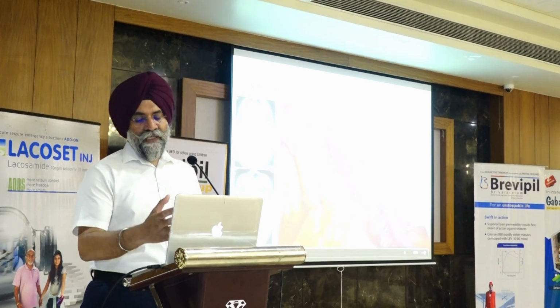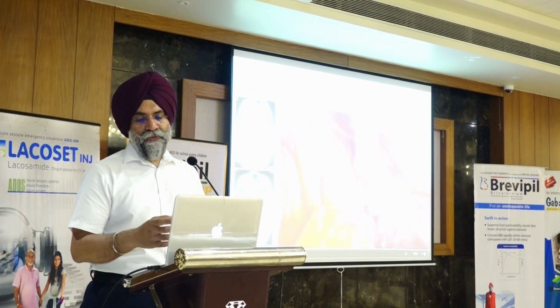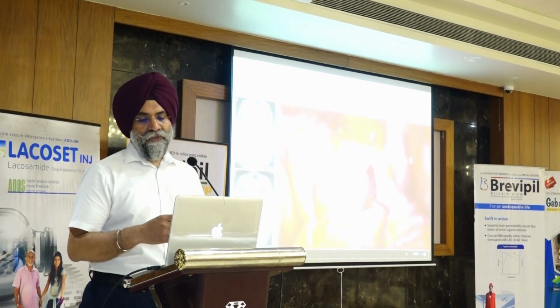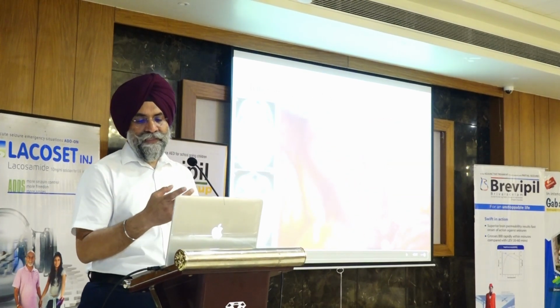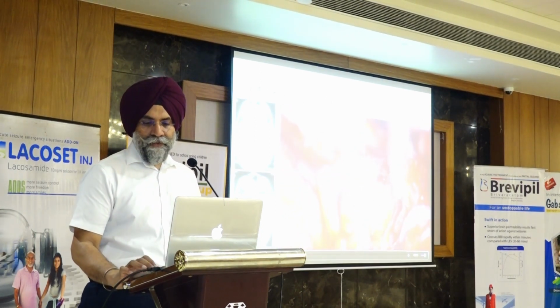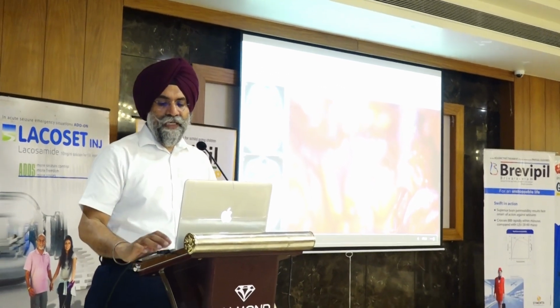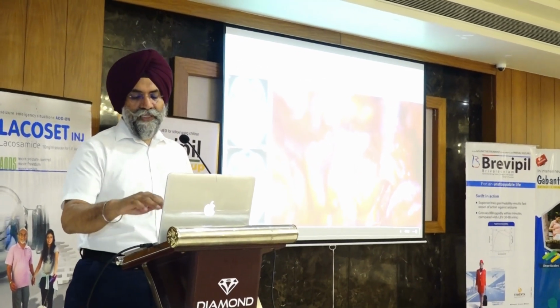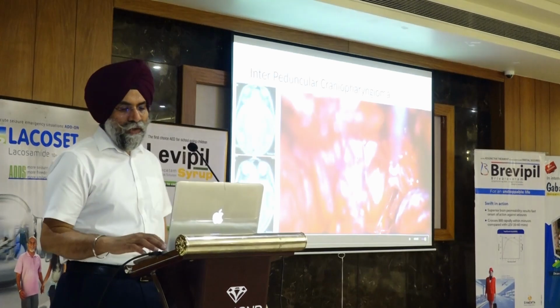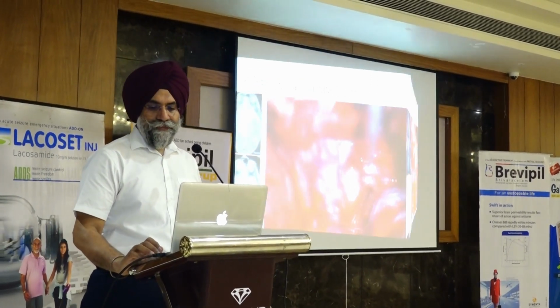So now see that this is such a big corridor, lateral and inferior to the internal carotid artery, and there are no manipulations or dissection in and around the optic nerve or the optic chiasm. So the tumor is taken out with this corridor, and no brain retraction of the frontal lobe is required. The only thing is that the temporal lobe is taken back along with its dura, and it didn't have any problem.